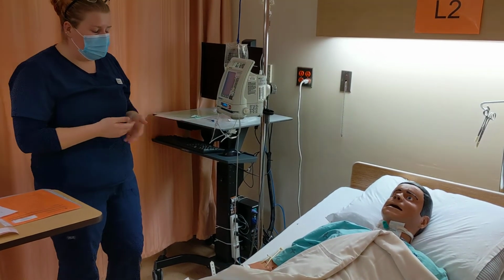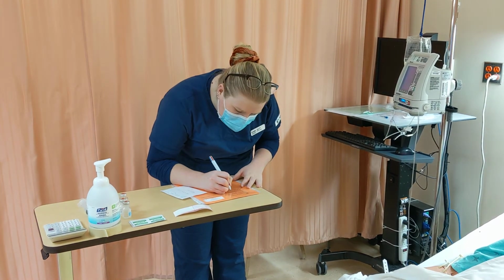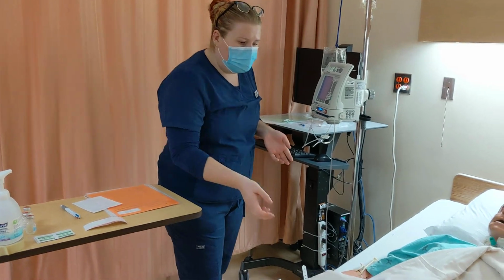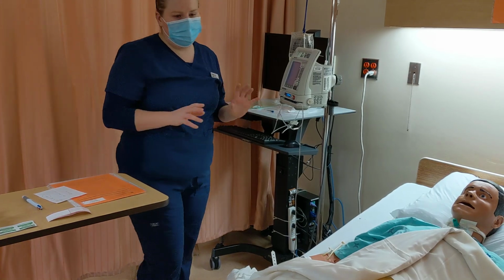After I've told them that I'll be back for all those things, I'm going to go ahead and document. I'll document the time, my initial and my designation. I'm also going to document on the ins and outs and the flow sheet. And like I said, I'll tell them that they can call me back if they need anything. I did my exit safety check and then we are done.